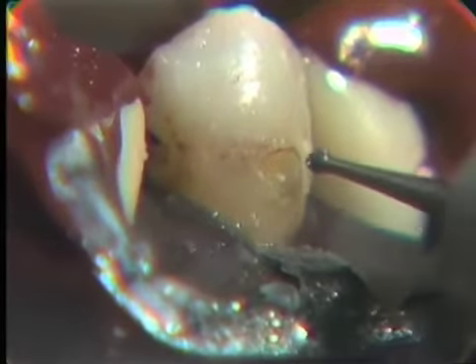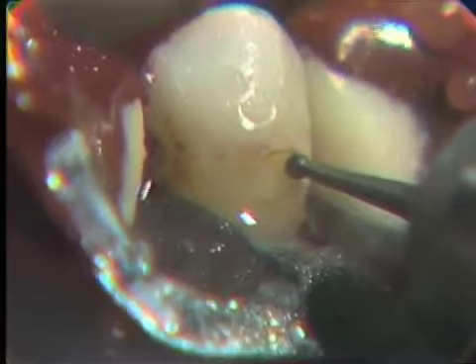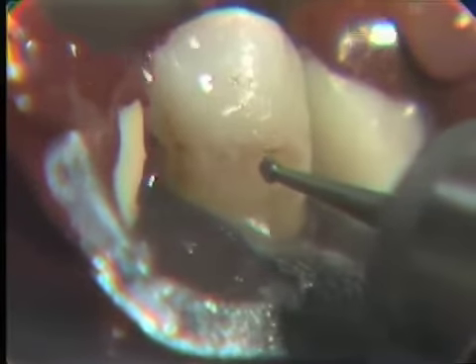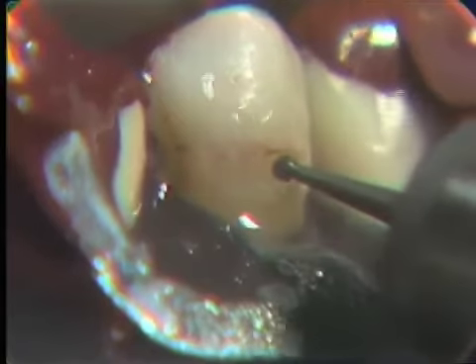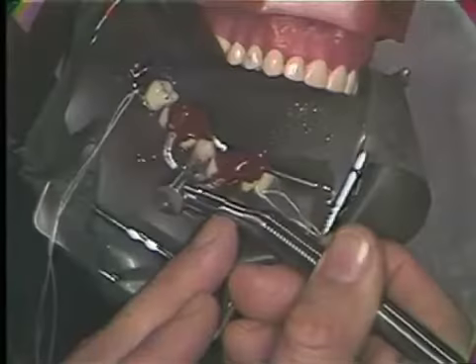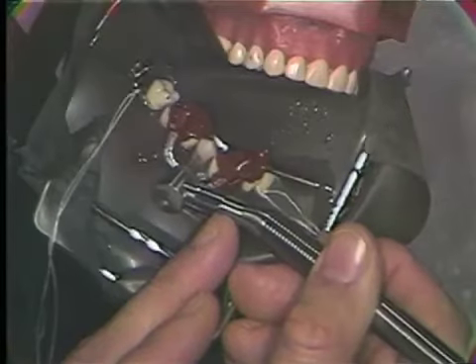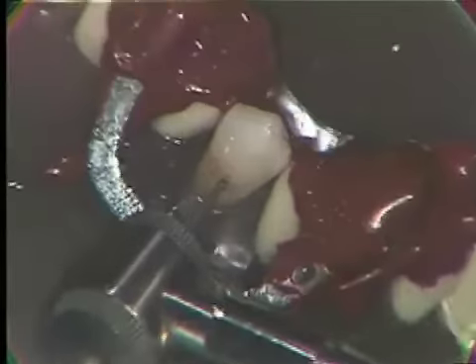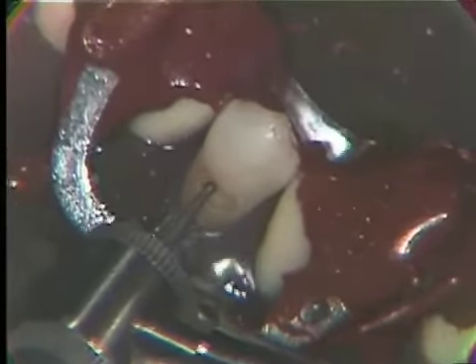We once again now will extend out. You can note that in many cases we are using both hands to steady the cutting as we proceed mesial and distally across here. Now, this happens to be a rather large carious area, and so therefore we're extending considerably to the mesial and to the distal with our round bur, being very, very careful to keep control over it at all times.